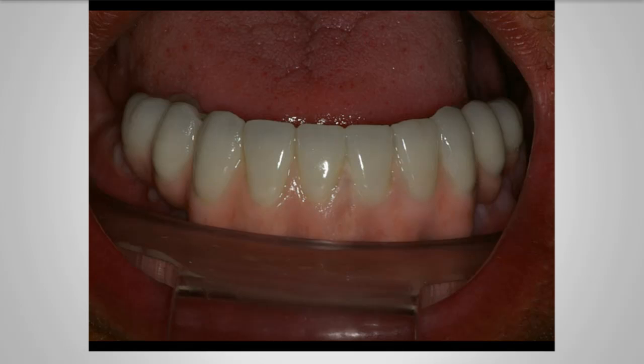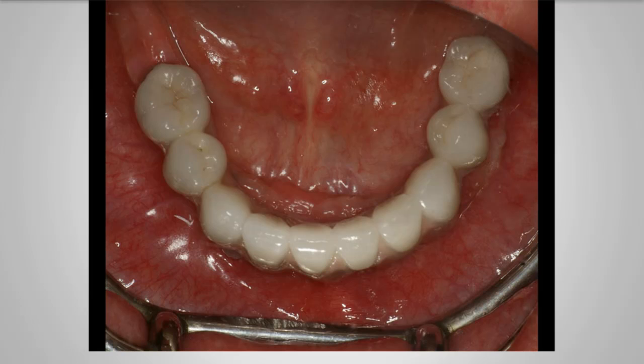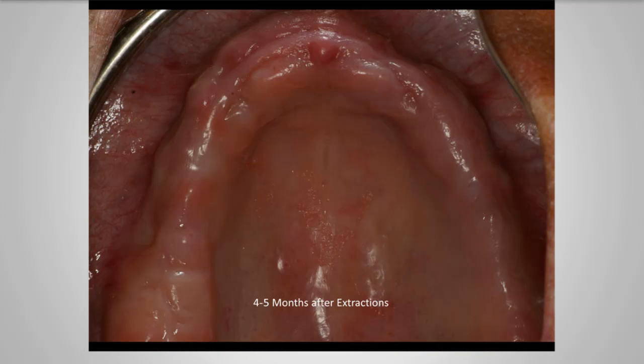And here we see the FP3 bridge from Burbank Dental Lab. We cement this into place and clean the excess cement. Here we see the retracted view, and the patient is happy that he's got a fixed bridge. We look at the occlusal aspect, and the patient is pleased because these are porcelain teeth, not plastic teeth that may discolor, or screw holes that may get some accumulation of problems. If need be, using the Dent Corp pneumatic crown remover, we can tap these off if necessary.